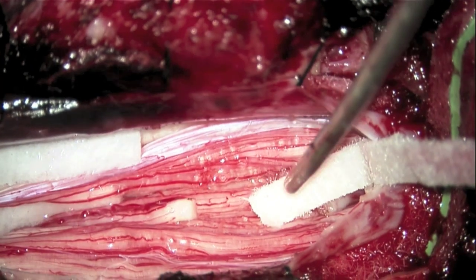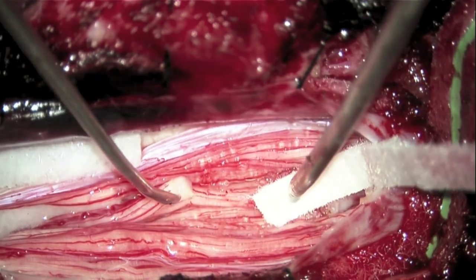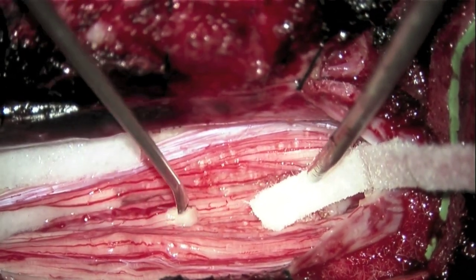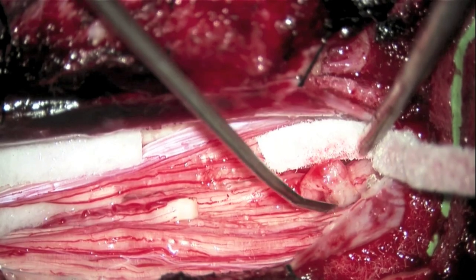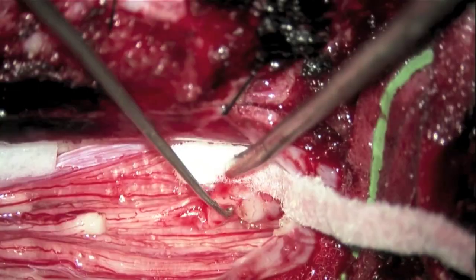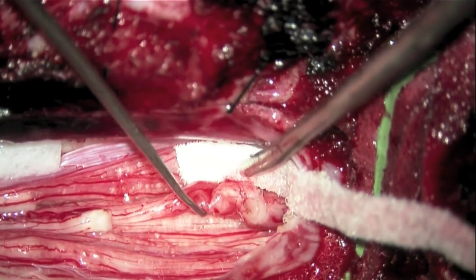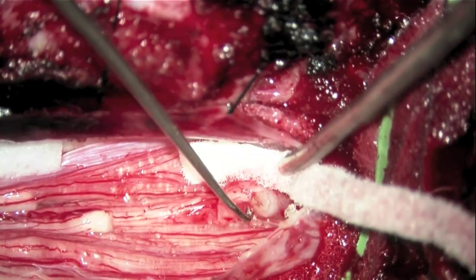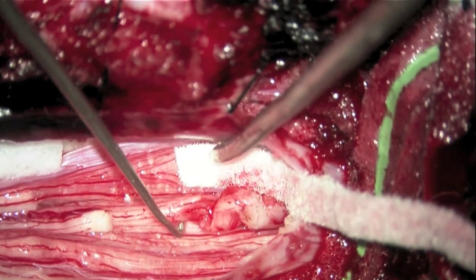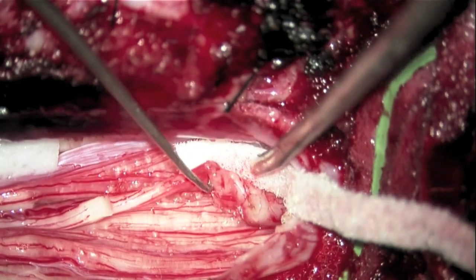Tumor resection is now complete. The afferent end of the divided nerve of origin is pointed out by the microdissector. The edematous redundant portion of the intact corresponding root is clearly seen. The anatomically and functionally intact corresponding right L4 motor nerve root is now mobilized. The distal efferent stub of the divided tumor nerve of origin is also seen.